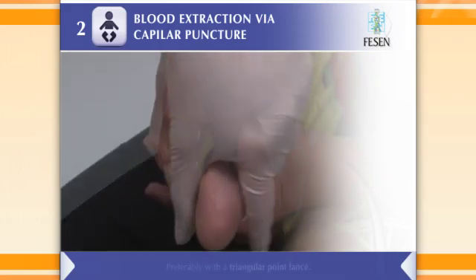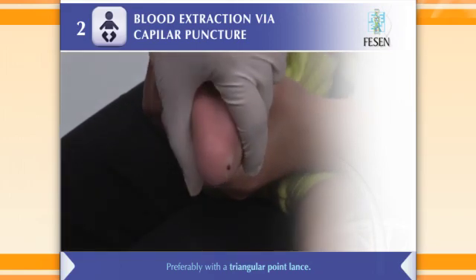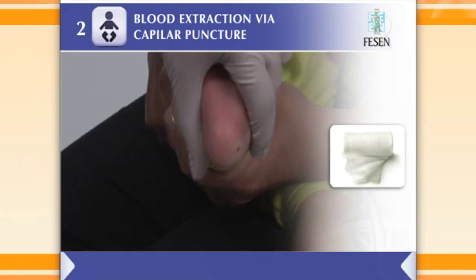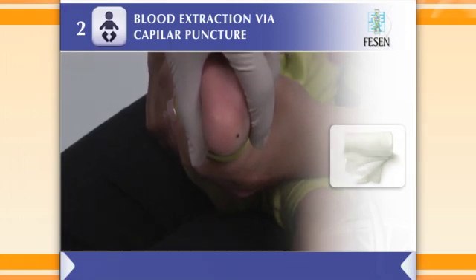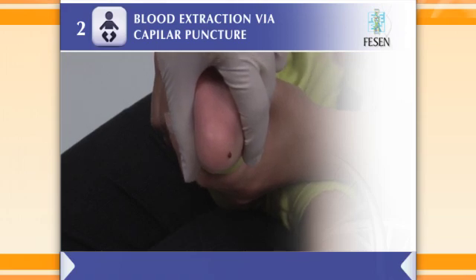Puncture the patient's heel or hand finger if the baby is under three months old. Dry and remove the first drop of blood that is formed with sterile gauze. Allow a voluminous drop of blood to form, slightly compressing the tissue around the puncture zone.